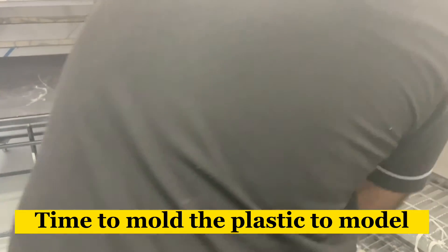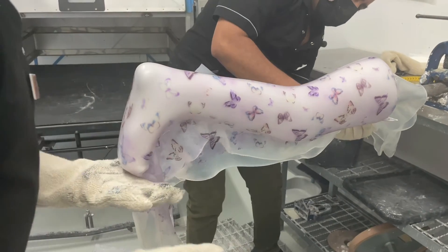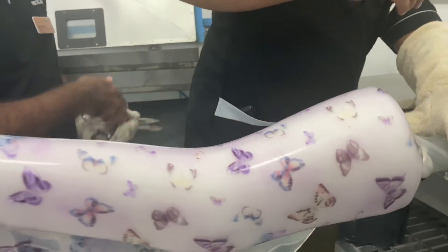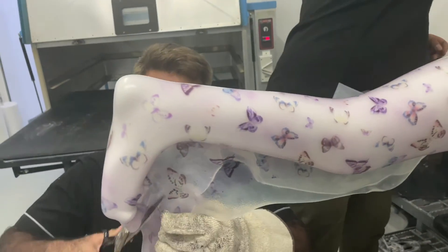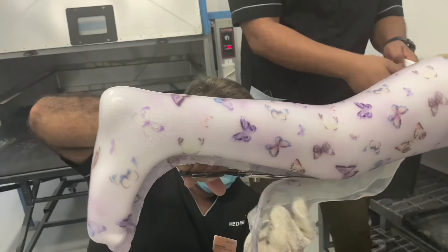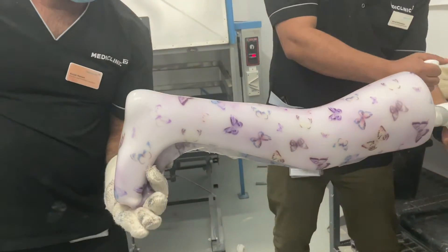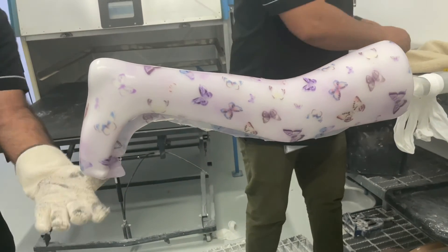Before placing the sheet, you need to close the interior part — both sides of the plastic. Once you are sure, switch on the suction machine. While doing suction, you need to cut the extra plastic on the front side, and tightly tie a knot at the attachment area of the model with the machine.